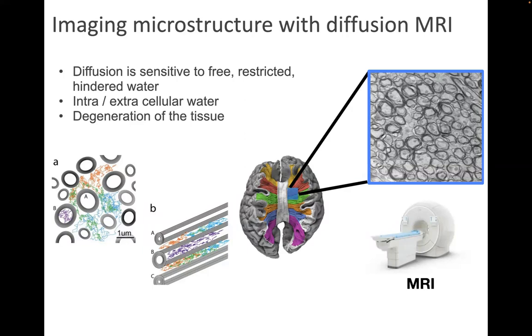I'm going to ask the MRI to tell me, okay, when you're measuring in X in this direction of the corpus callosum, what is the speed of water molecules? And what is the speed of water molecules in Z and Y? And we're going to do this in 3 dimensions. Put this in an algorithm and try to reconstruct the 3-dimensional apparent diffusion coefficient.